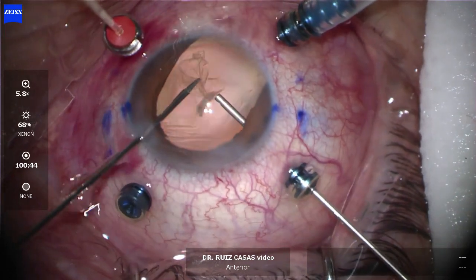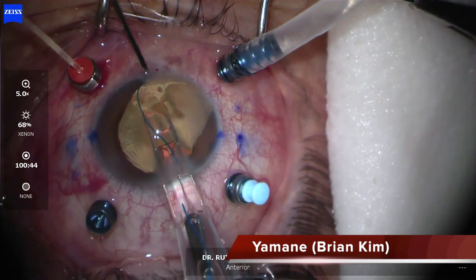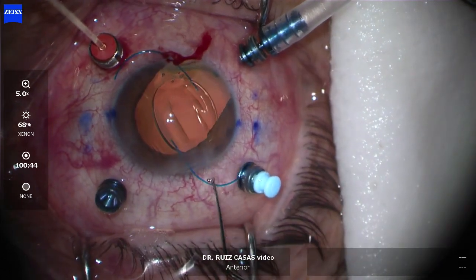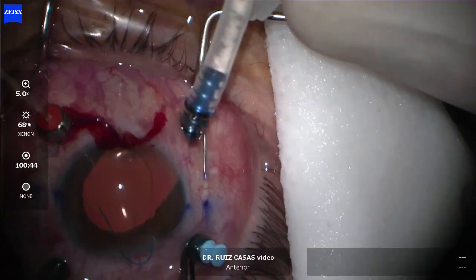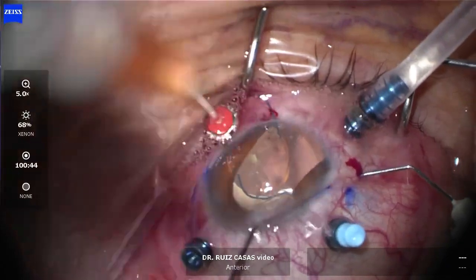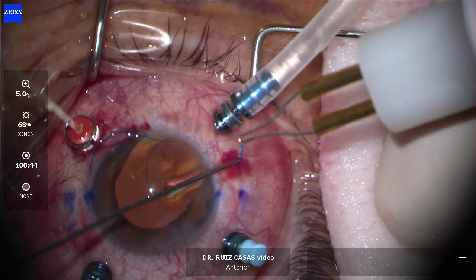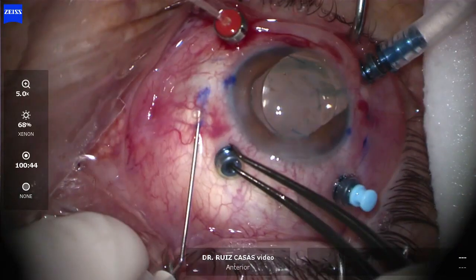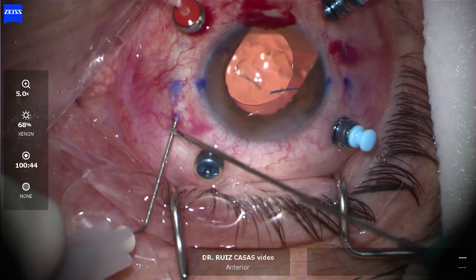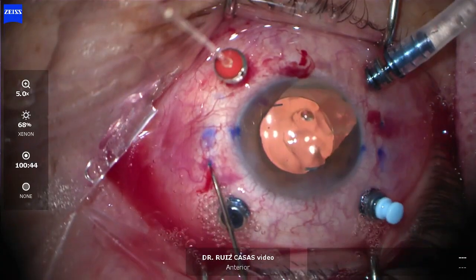I'm removing the capsular bag and in this case I'm doing the Yamane technique with the Brian Kim modification. I'm implanting the Lucia CT202 IOL, taking out the superior haptic and then the inferior one, creating long tunnels with a 27-gauge needle. Once both haptics are out, I cut the tips and bury them into the 2mm scleral tunnels I created.